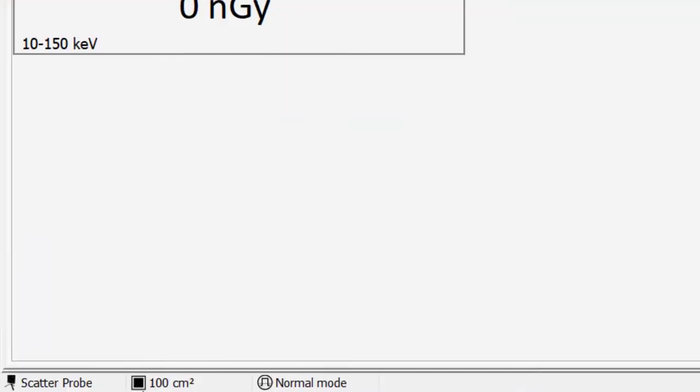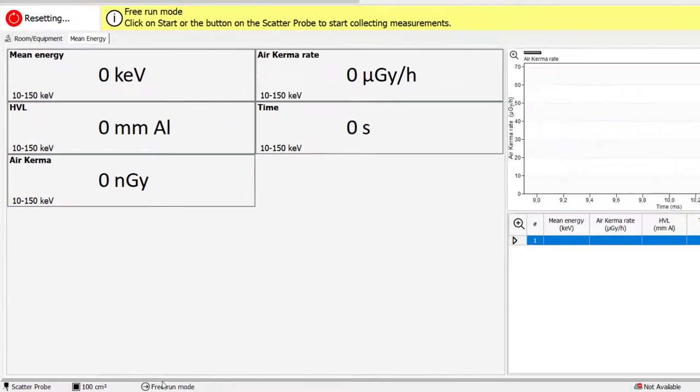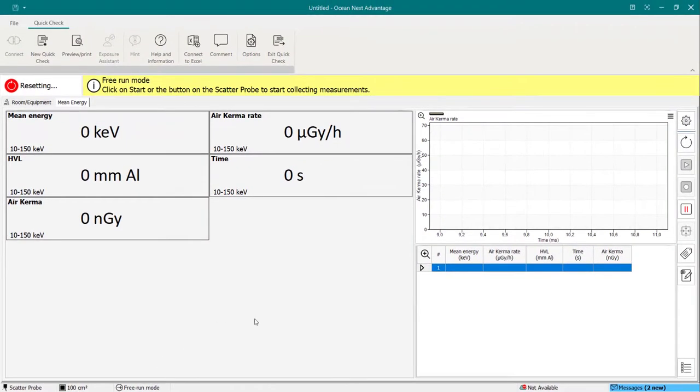There's also a tool to set and change detector area, as well as measurement mode. For some situations, you may want to use the free run mode if you have very weak signals that are below the trig level.